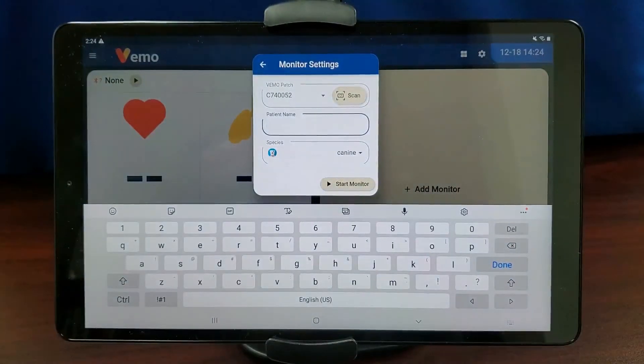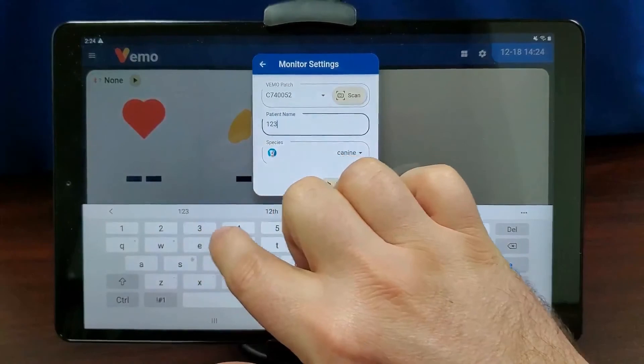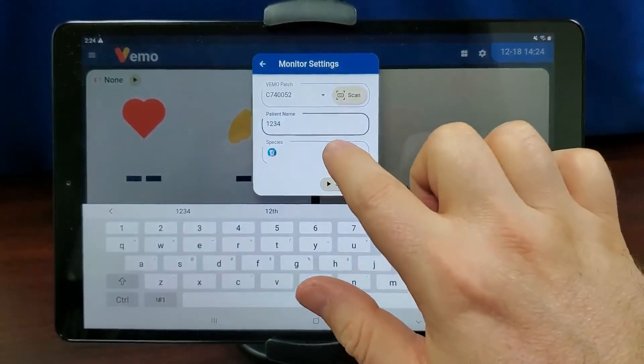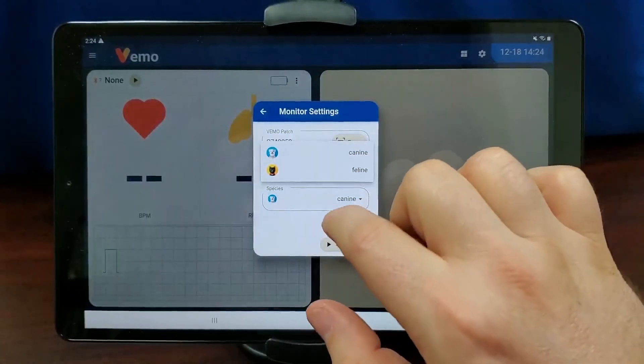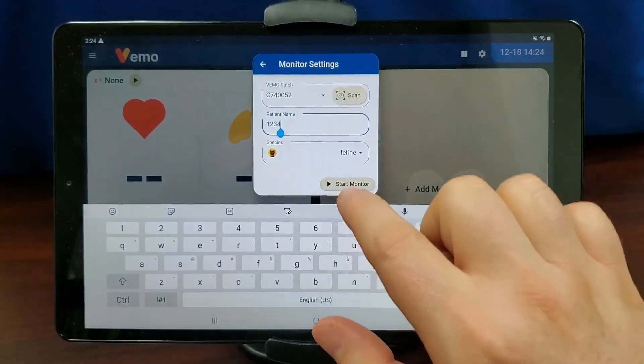Input the patient information. Choose canine or feline for the species. Tap Start Monitor.